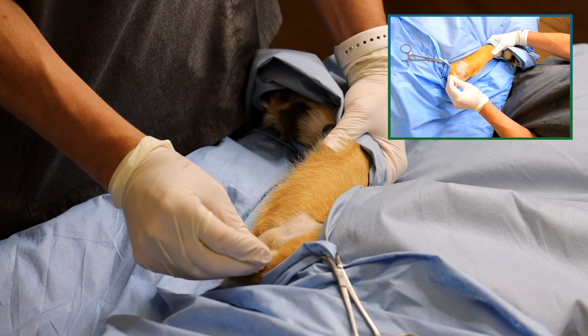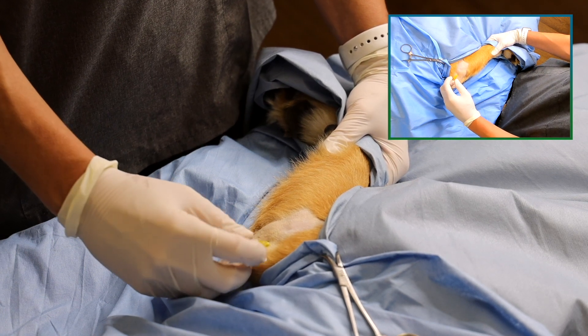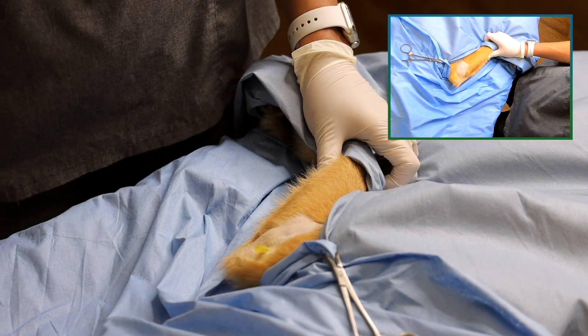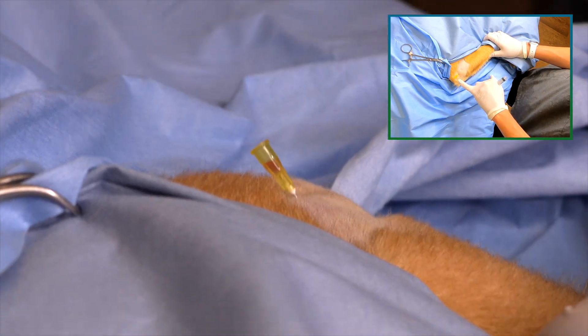Advance the needle into the joint. Rotate the needle to clear the bevel and observe if joint fluid is present. If there is no joint fluid present, you may want to aspirate with a 6-ml syringe. In this case, it was not necessary as we can see fluid in the hub of the needle.